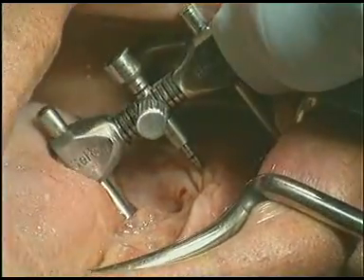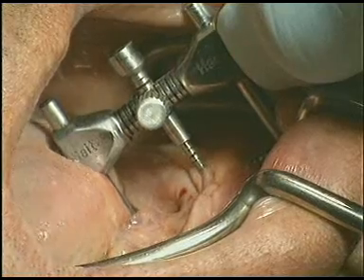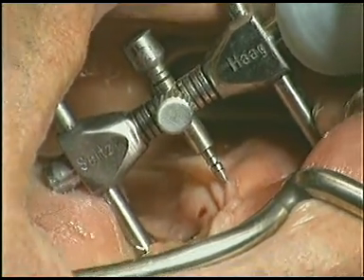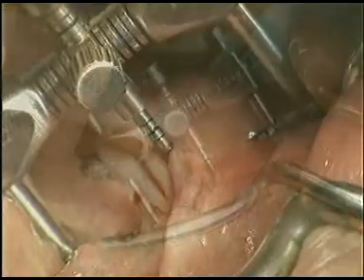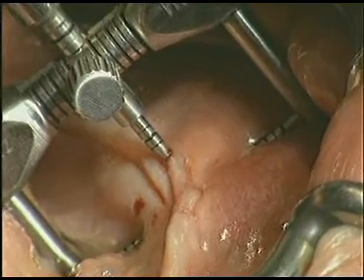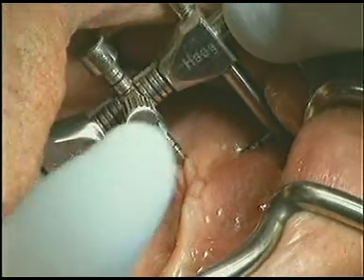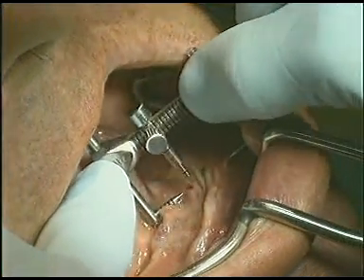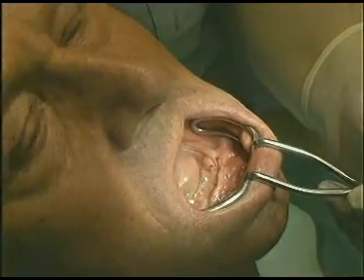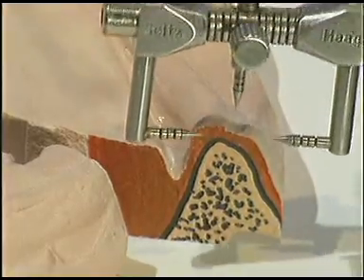The 3 points are calibrated in millimeters and are first set at a defined height with the vertical pin. The 2 transverse pins are then pressed through the lingual and buccal mucosa and onto the bone. The thicknesses can be read off the slide and transferred to the section model to map the bone.